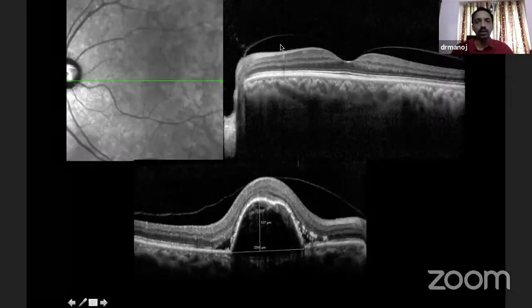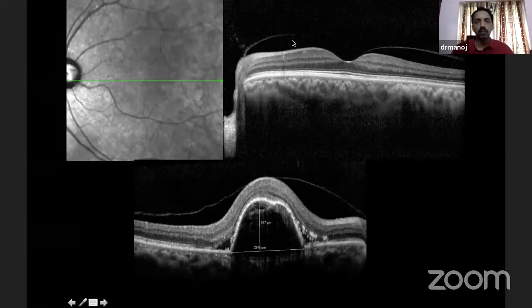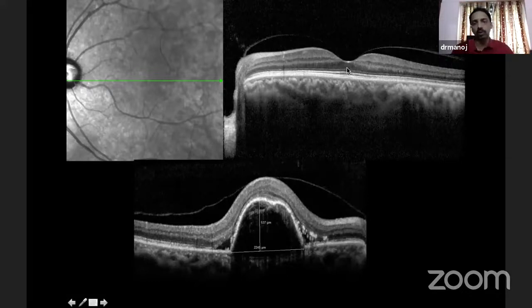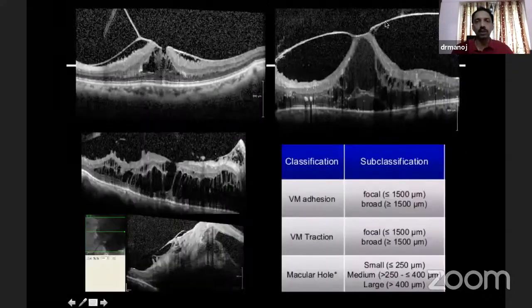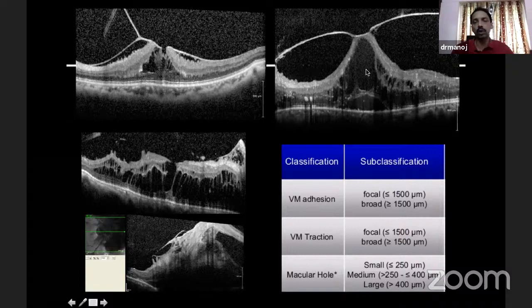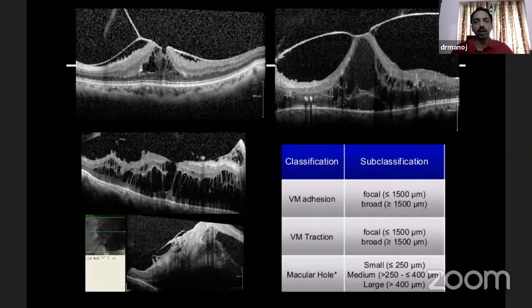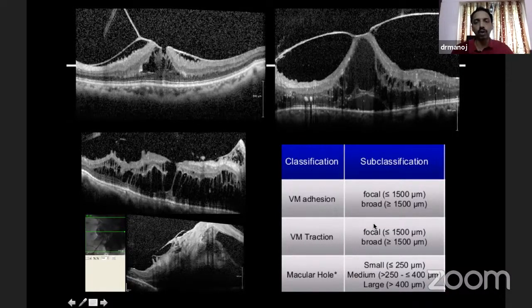You look at the vitreous. Here you see a thin membrane reflectivity — this is called vitreomacular adhesion. In vitreomacular adhesion, the foveal contour is not altered; that's the most important thing. In contrast, when you see membranes which have altered the contour of the fovea, we call it vitreomacular traction. These are the two terms — vitreomacular adhesion and vitreomacular traction — and based on size, they are further classified as focal and broad.